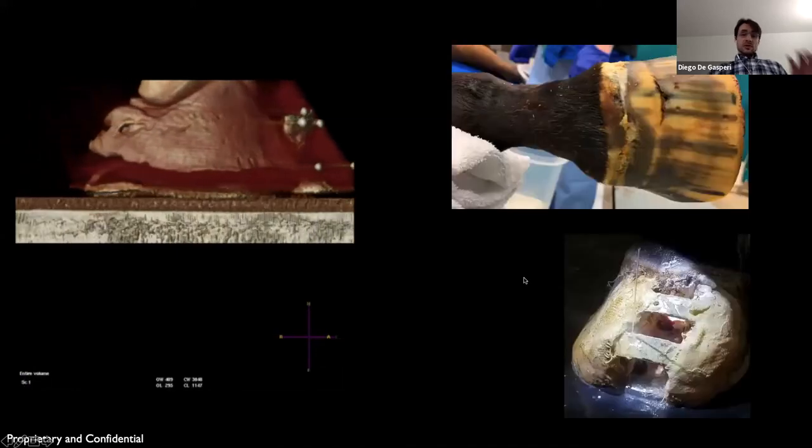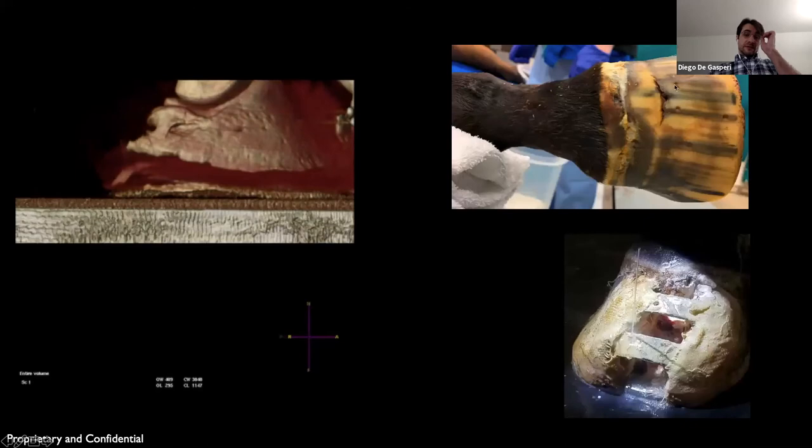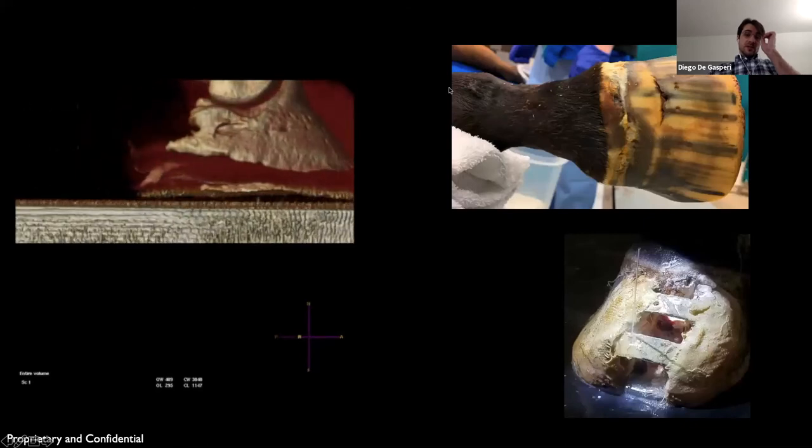The pictures on the right show the foot with the horse under general anesthesia. After removing the barium paste, we grooved those areas a little bit just to make sure we had our landmarks the day of surgery, which was the next day. The hoof wall was resected at this area, as you can see on the post-op picture here. And the mass was submitted for histopath and confirmed to be a keratoma.